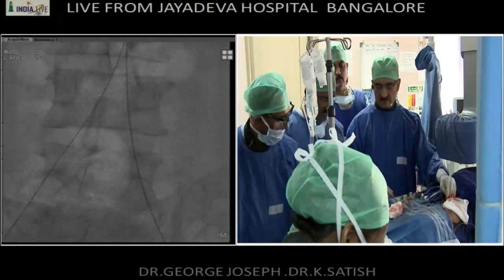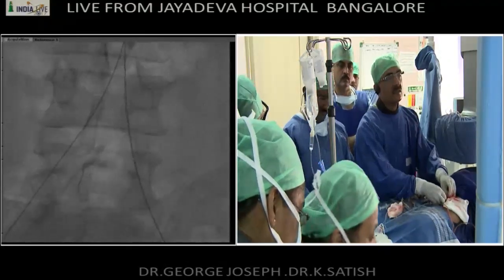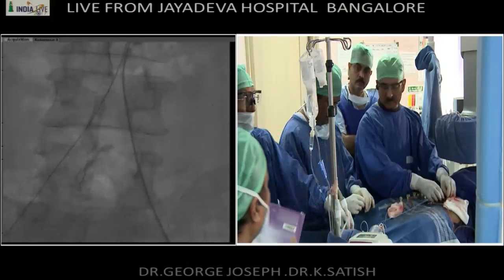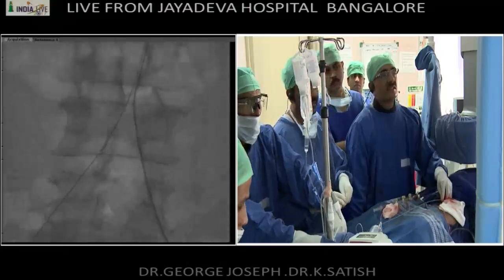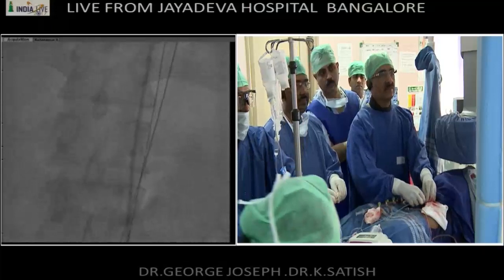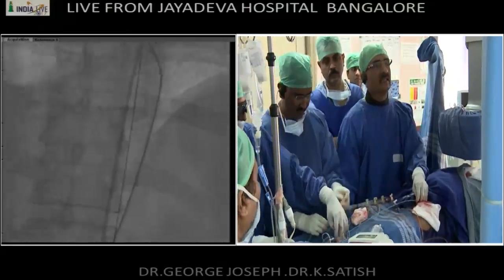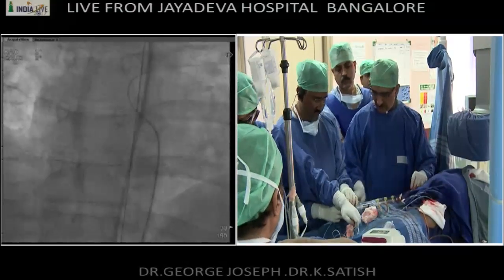Do you plan to put two self-expanding stents, or you want to put a covered stent? Or are we going to use balloon-expandable? Balloon expandable stents. I prefer that because of precision and radial strength. Okay, put the Amplatz wire into that. Now the same thing on this side.